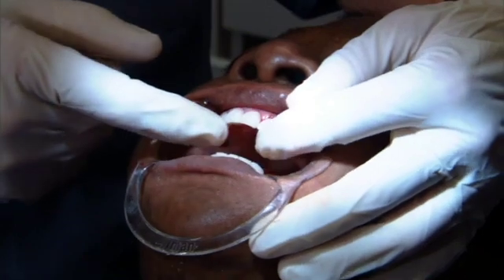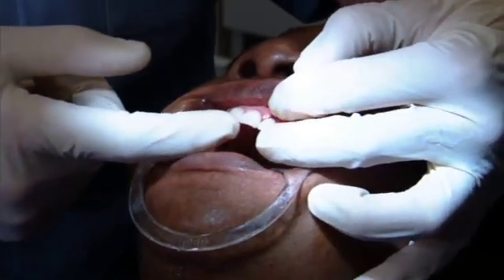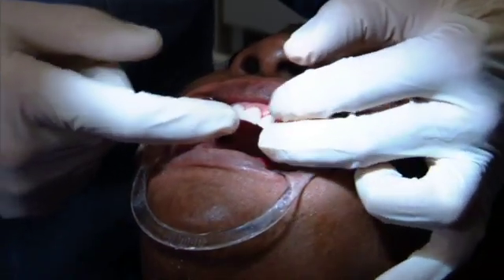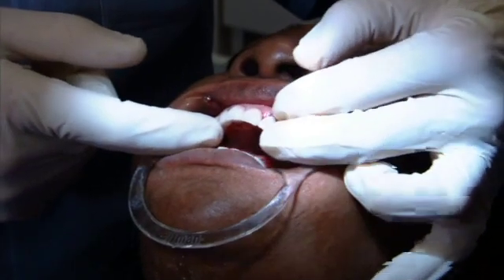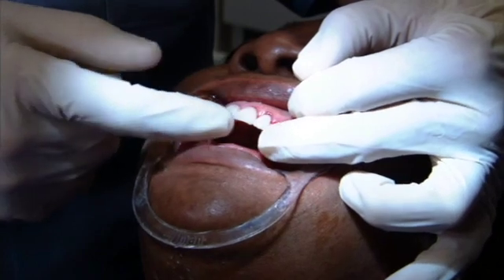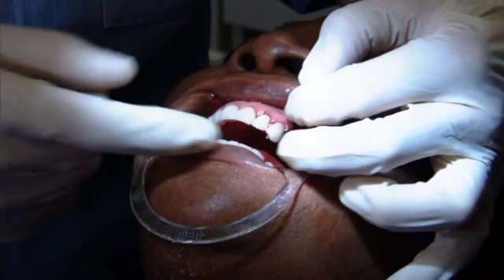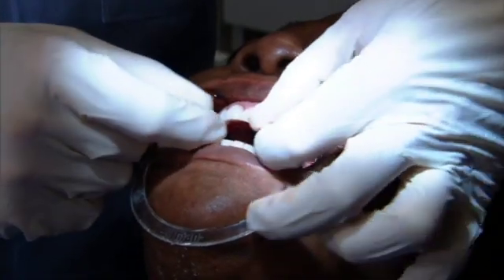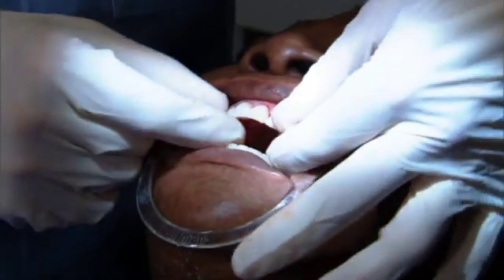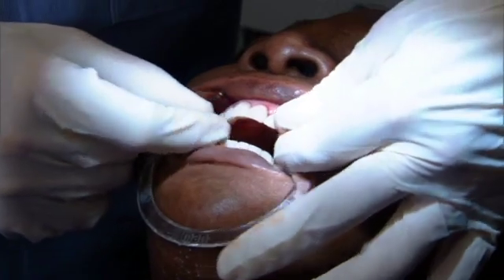Open for me now. You'll notice, too, that we got rid of Beverly's diastema. We talked to her about the fact that she had a little space between her teeth, and she reported to me that that space didn't really come up until she started having some periodontal problems. And so we elected to close it back. Now, if she doesn't like it closed, in our final product, we can open it back up. But for our provisionals, this is going to give us a lot of strength for these things to stay good and solid during her healing phase.